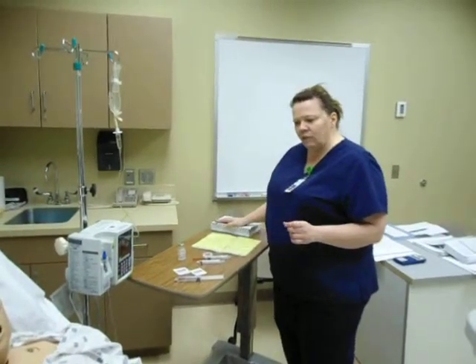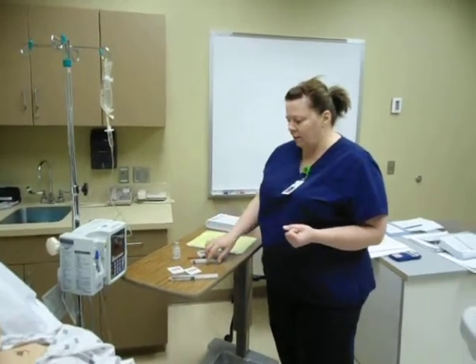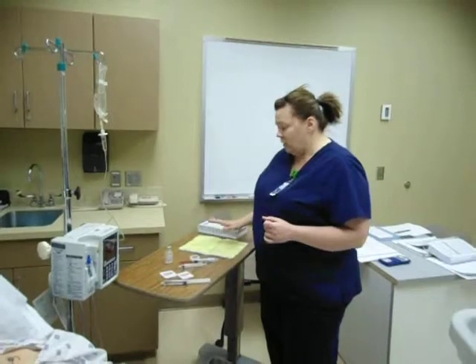Since he's an elderly patient, I need to give it over 3 minutes, the IV push. So I'm going to also be drawing up some normal saline to be able to dilute it, and so that'll be easier for me to give it over the 3 minutes. And so I've done all that.